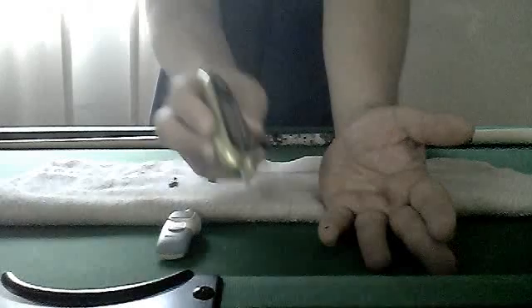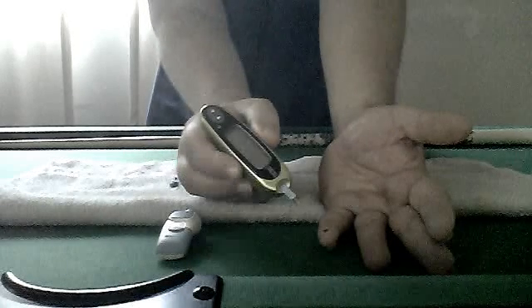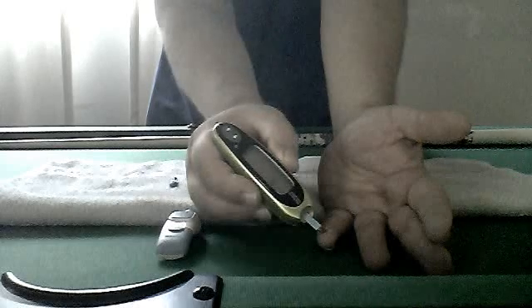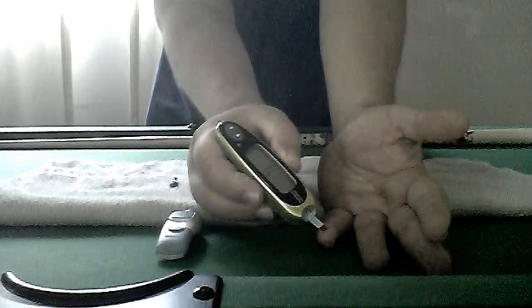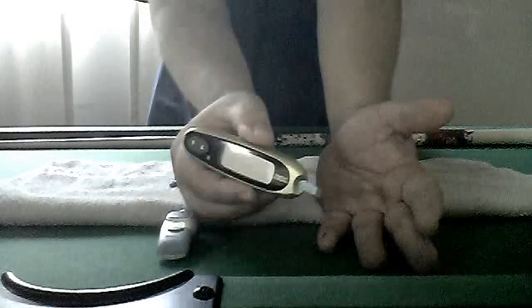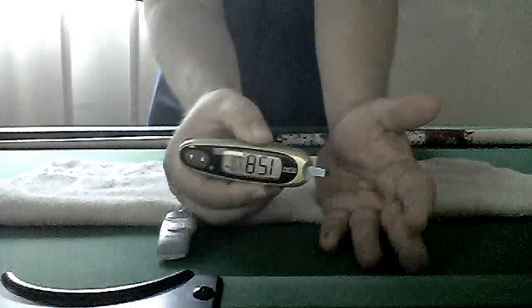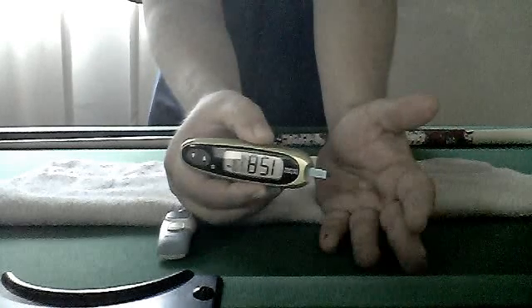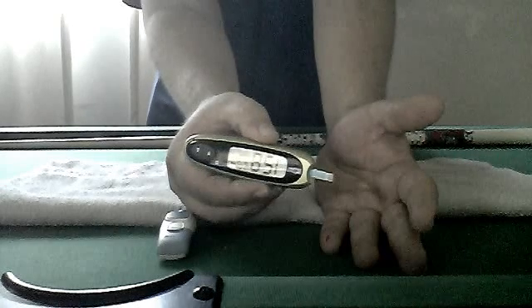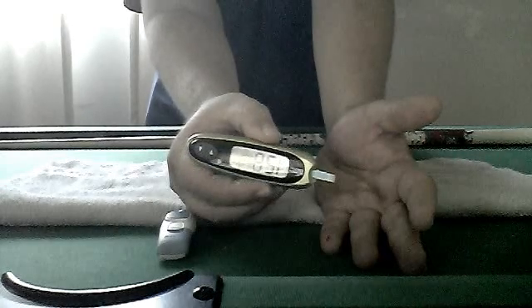Now I'm going to touch the blood with the strip — watch. There, I just did it. Now this thing is counting and it will give me my blood sugar level. And there it is — 158. That's all there is to it. All machines work under the same principle.